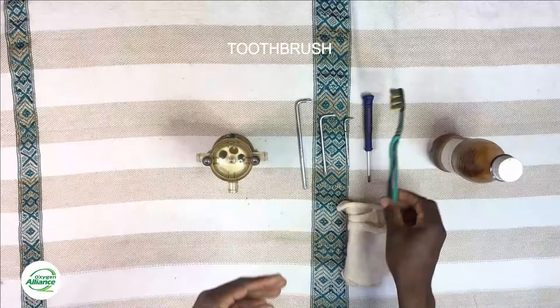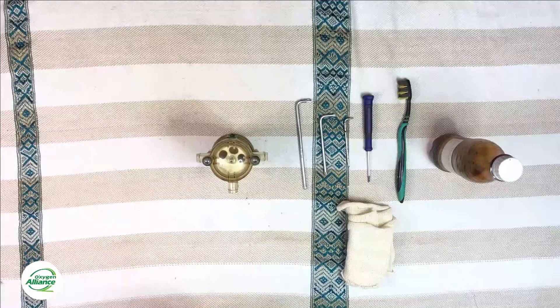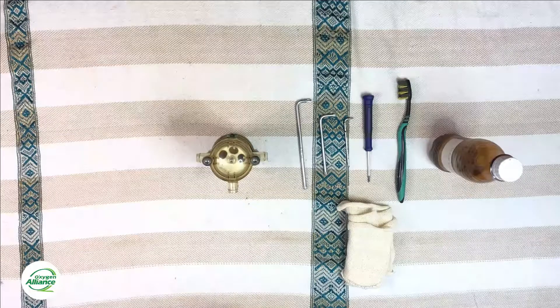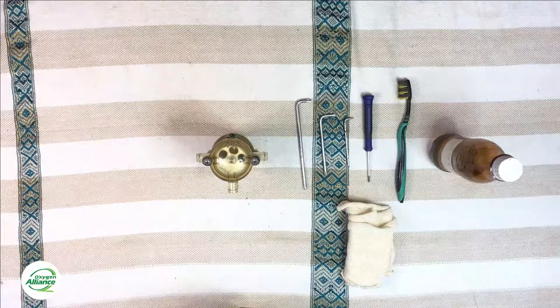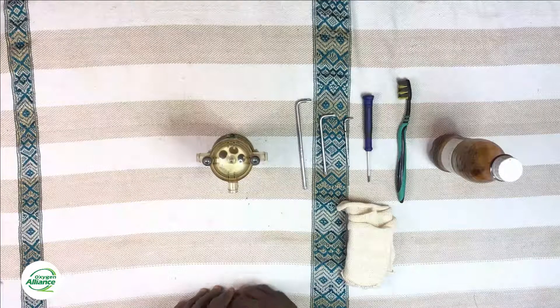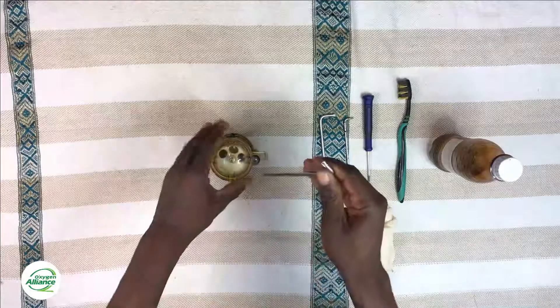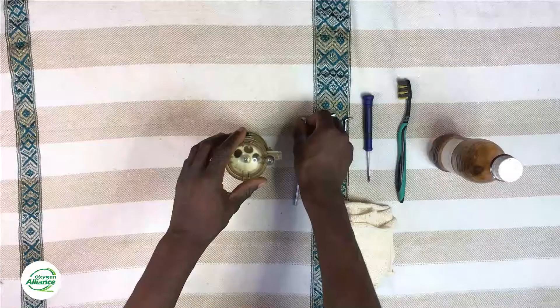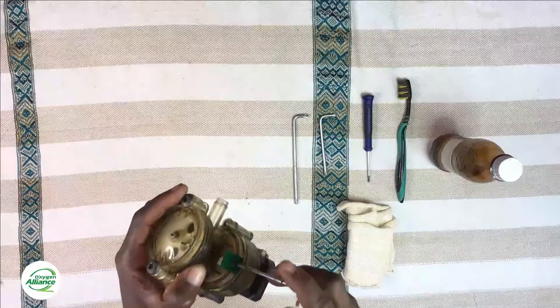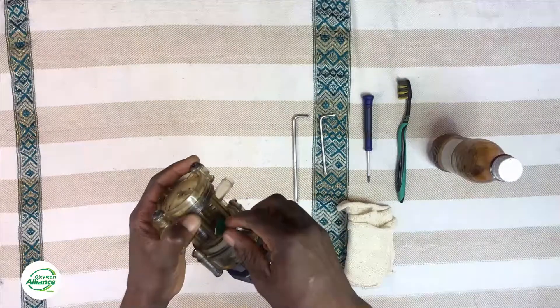In case you have issues with gears or the o-ring in your rotary valve, you also need to have the replacement kits for those components. Getting into the disassembly now — firstly, you need to remove the Hall effect sensor so that we don't damage it during disassembly, since it is fragile, so we need to make sure that it's safe.